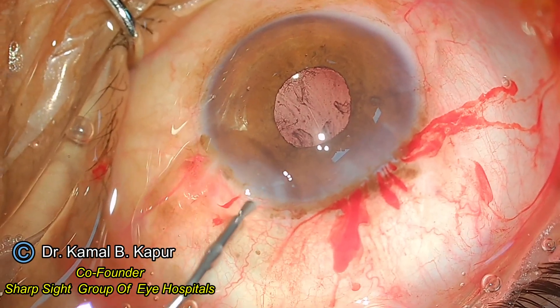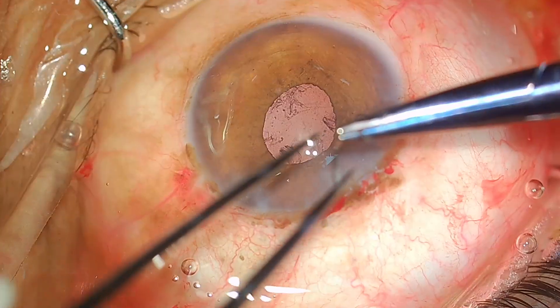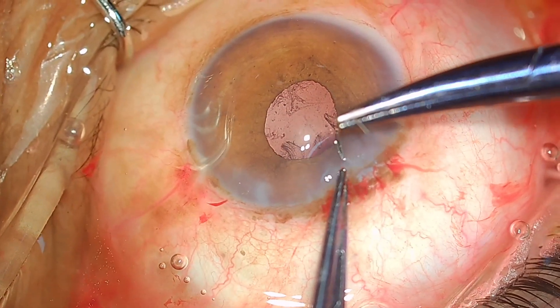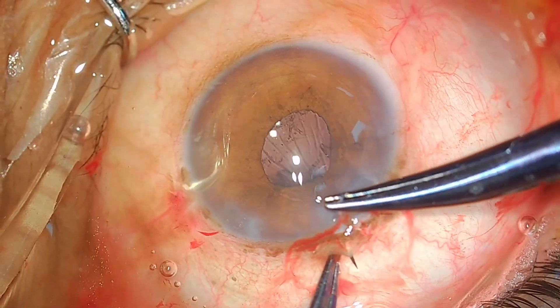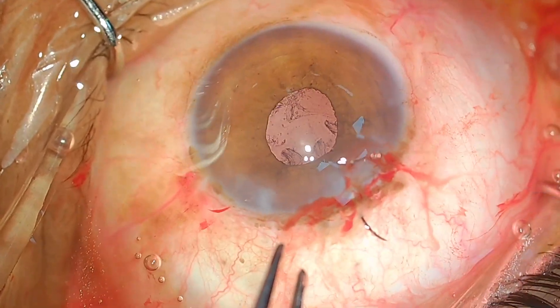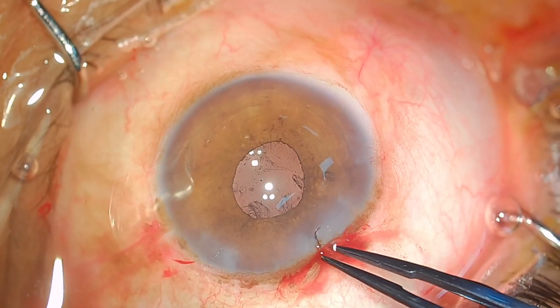The wound is approximately 1.75 millimeters on either side. The technique of holding the suture needle: hold the needle from the posterior one-third at the junction of the anterior two-thirds — that way you can go through both lips of the wound in one single pass and the suturing becomes very easy.